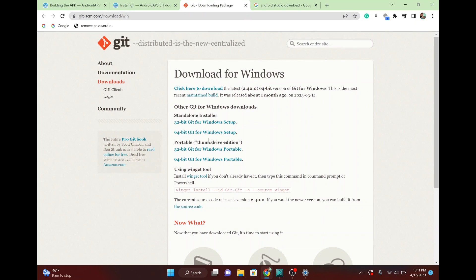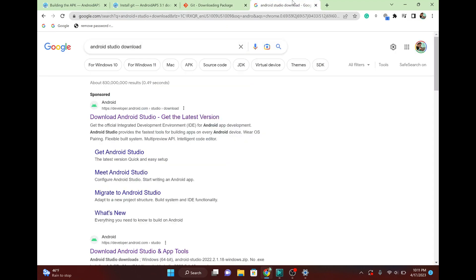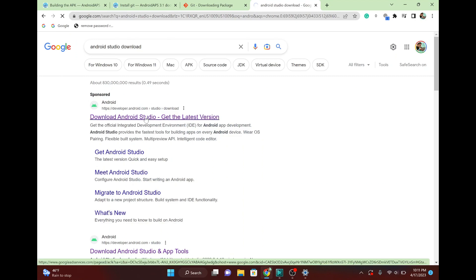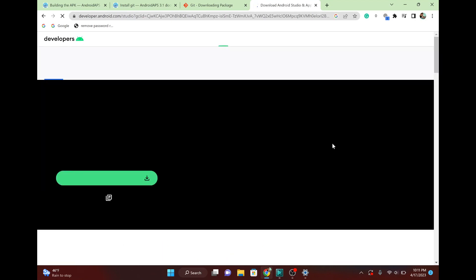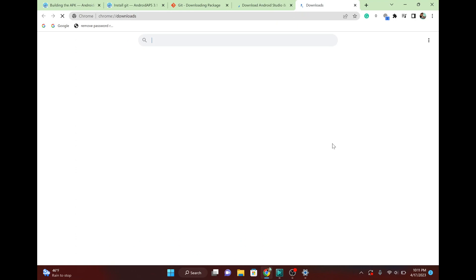And then while that's downloading and getting set up, do the same thing for Android Studio. You're just going to Google Android Studio download. And then click on that and download it. I already have these downloaded, but I just downloaded them yesterday, April 16th. So if you're doing it anywhere close to that, this will be the exact same. But even if it's updated, the process is going to be more or less the exact same.